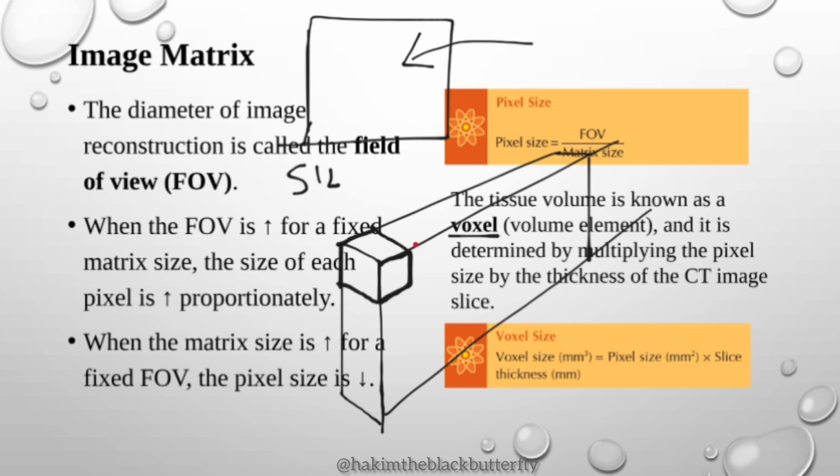If you want to create very thin slices with good spatial resolution, with less noise, you must increase the technique, that is, increase the mA, such that you can have a large intensity going through that thin slice.